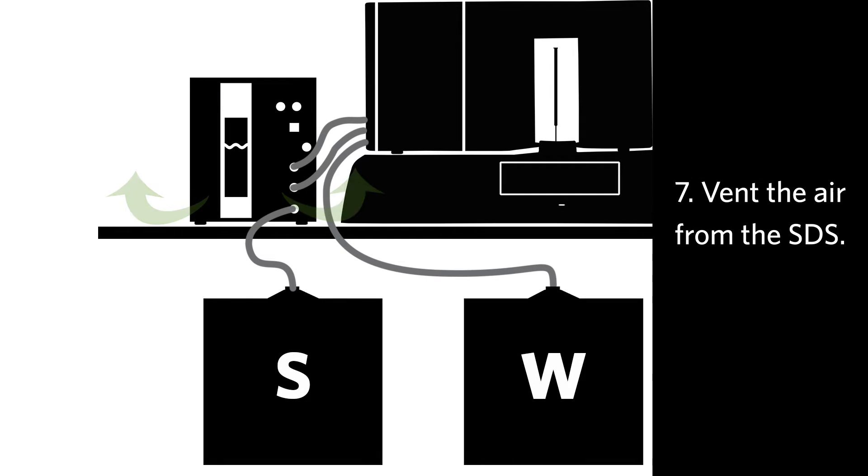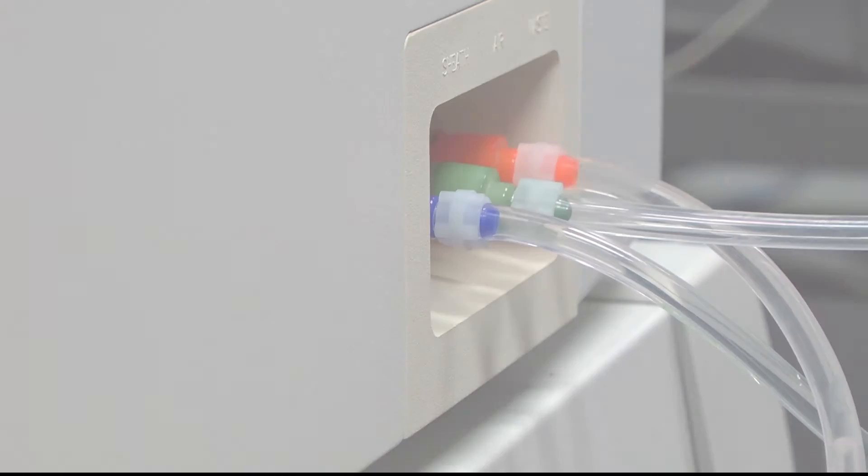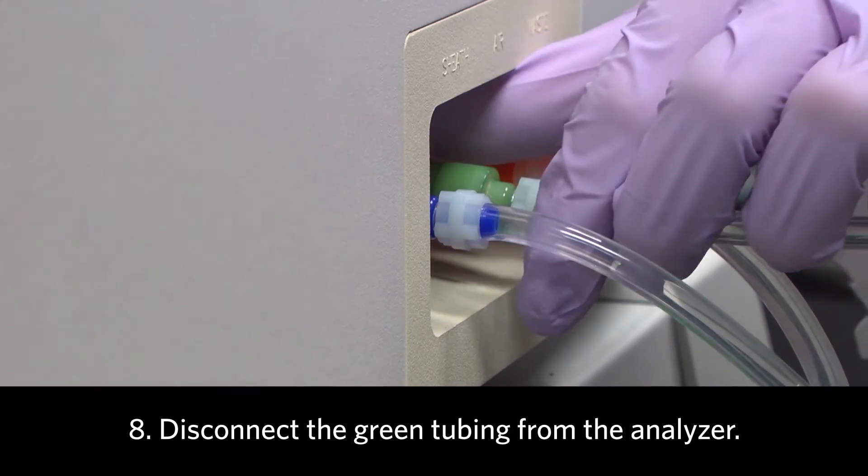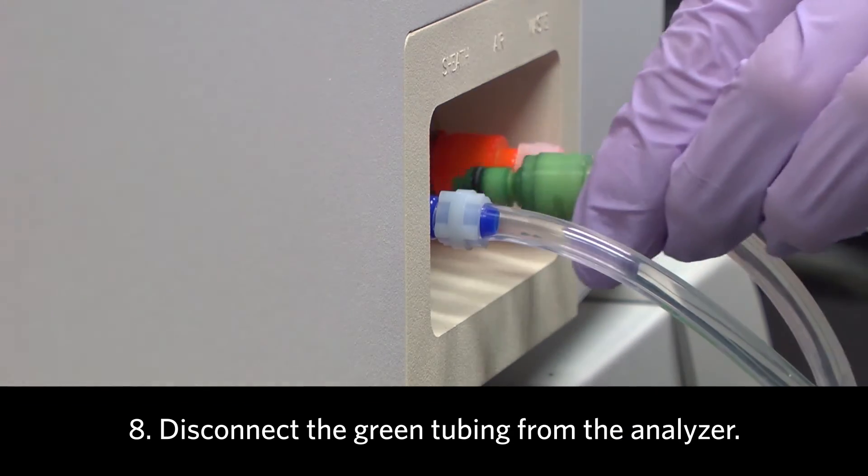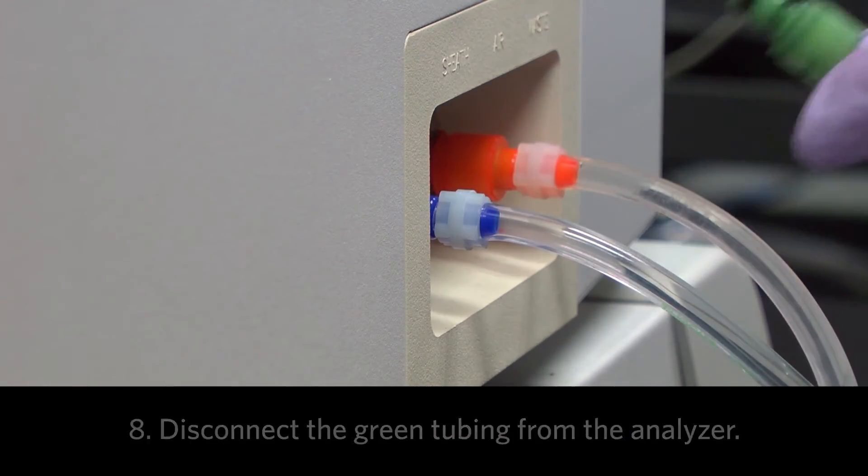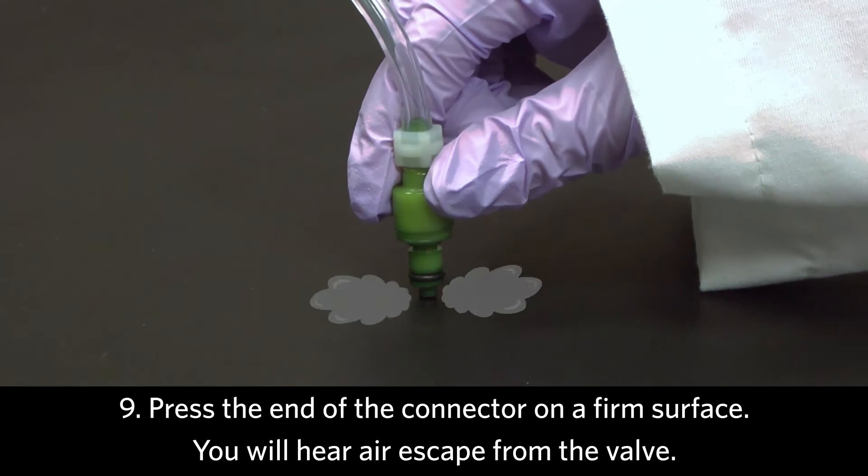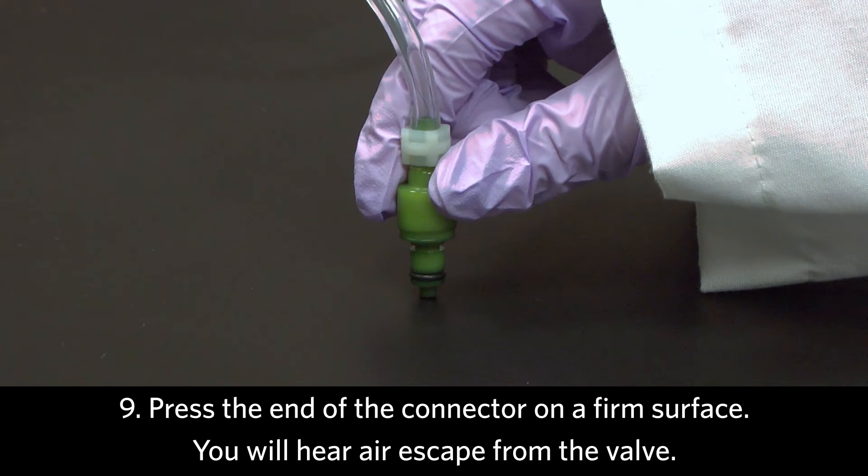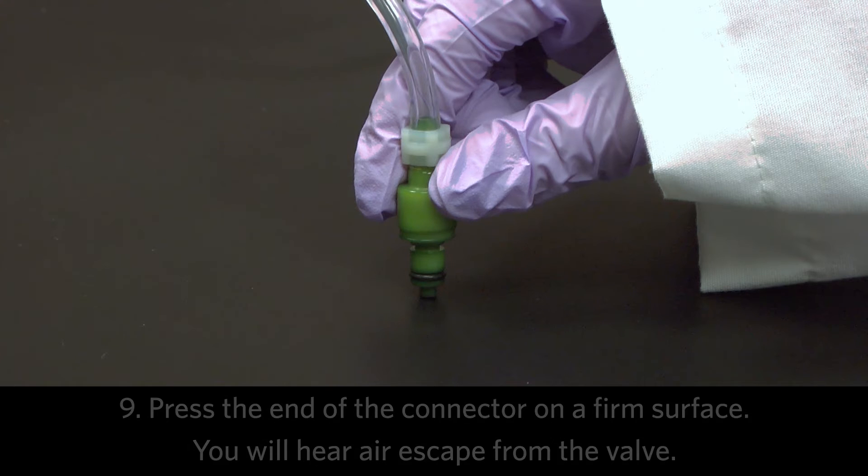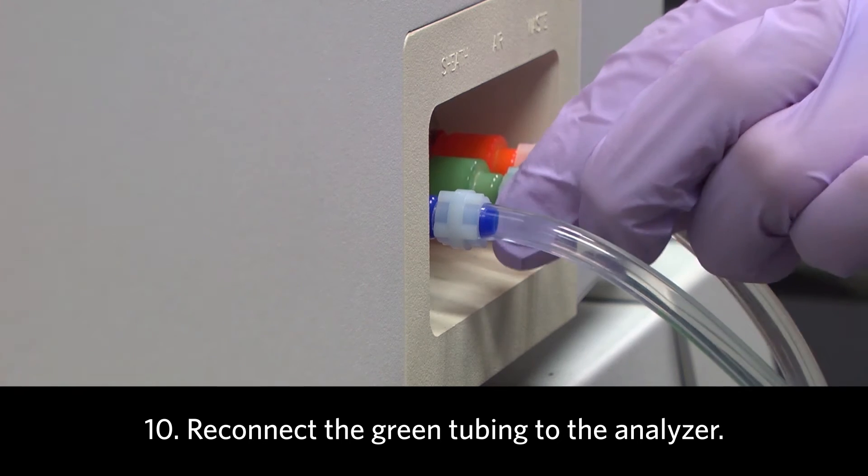Next, vent the air from the SDS. To do this, disconnect the green air tubing from the left side of the analyzer. Then press the fitting at the end of the removed connector against a firm surface. You will hear air escape from the valve. Reconnect the green tubing to the analyzer.